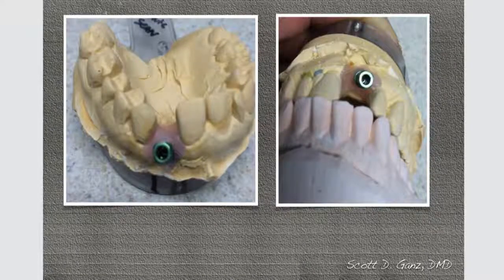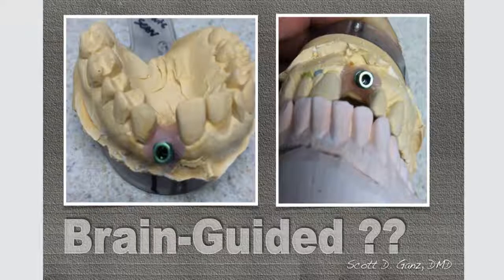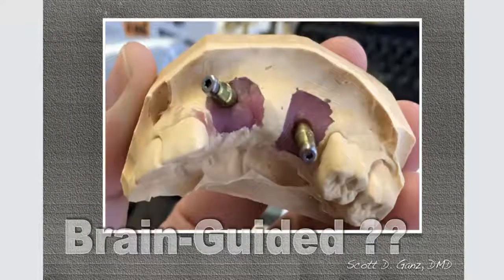Many years ago, I came up with this concept called prosthetic gymnastics. Now, would you call this brain-guided? I'm not sure. Take a look at some of these images. These are actual cases that I got from social media, and these are from different laboratories. Look at the positioning. You can't make this up. These are angles that are difficult to restore.